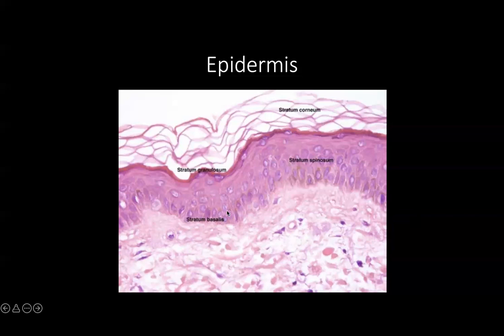Now, the turnover to go from the basal layer all the way up here could be up to 2 weeks or 14 days, and going from the stratum granulosum to the stratum corneum can be another 2 weeks. So, but every month, essentially, your epidermis renews. So why do you keep the moles that you have? Because the melanocytes are not dividing that fast, and the melanocytes are the ones that are producing the pigment. They're the ones that are sticking around. They're not renewing nearly as frequently as your keratinocytes.